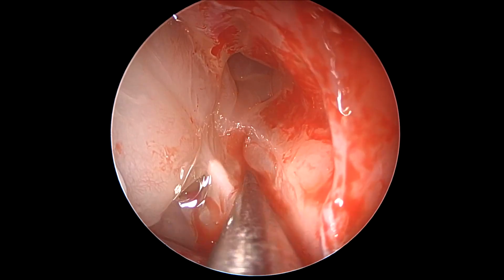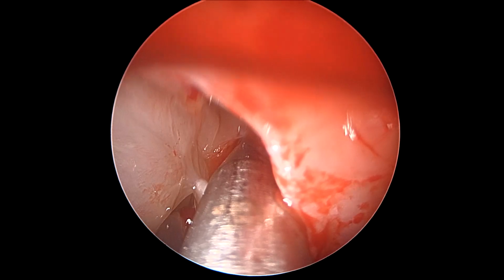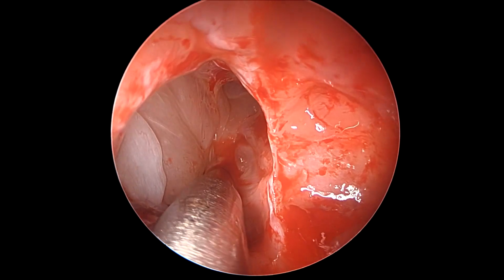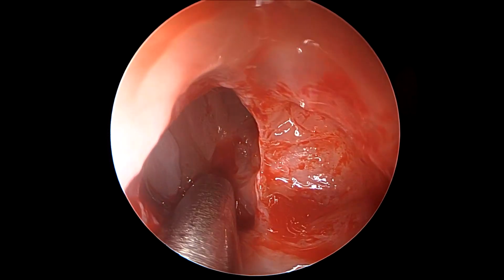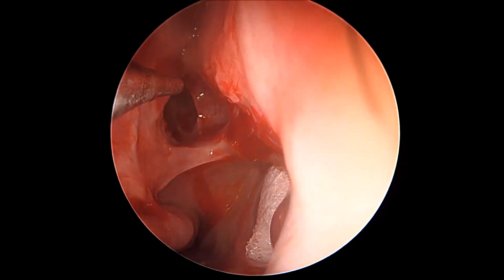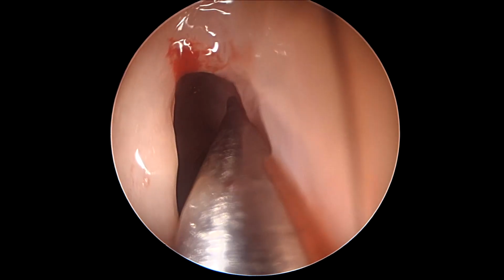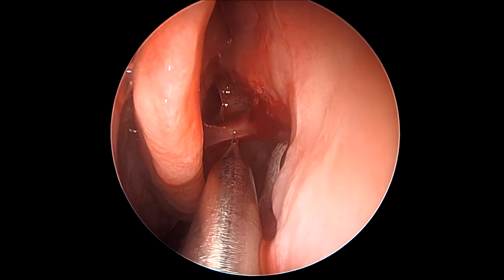So here we see that our probe immediately points towards the lowest most part of the skull base at the sphenoid, and we can track going from posterior to anterior following the possible trajectory of the skull base, though right now the skull base is not visible to us. The axilla of the middle turbinate is a very important landmark when it comes to locating the frontal recess and eventually the frontal sinus ostium.